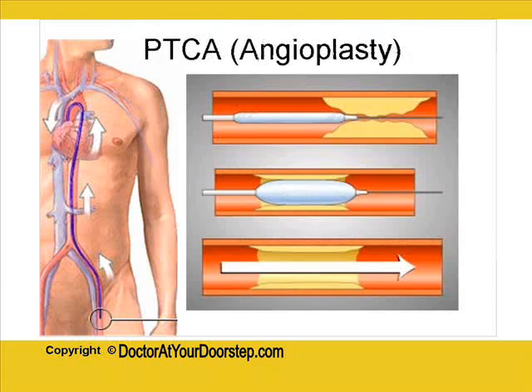The next most important thing to talk about is angioplasty, technically known as PTCA. Once again, on the left side you can see the human figure. There is a catheter which has been placed and has reached the heart, very similar to what you saw earlier in the angiography slide. But here, through the catheter, we push a structure which reaches the place where there is the blockage. This structure is a kind of balloon.